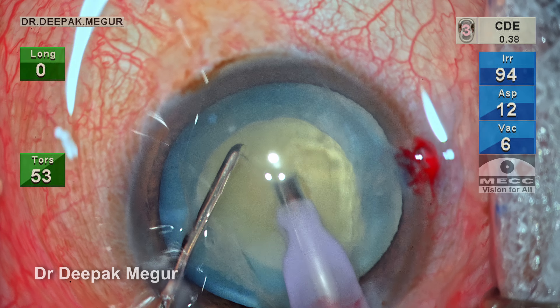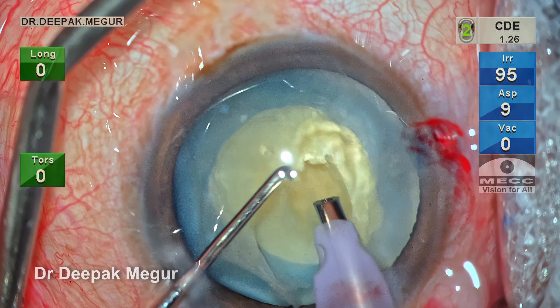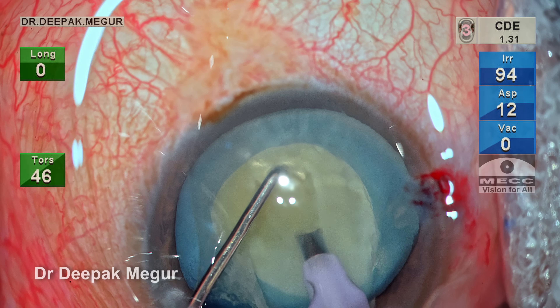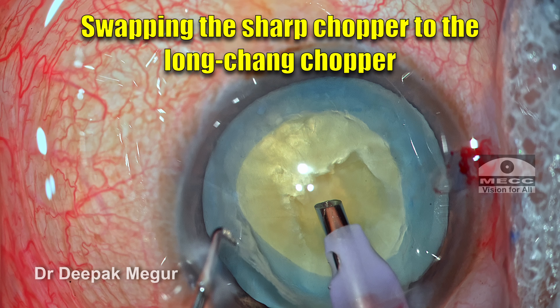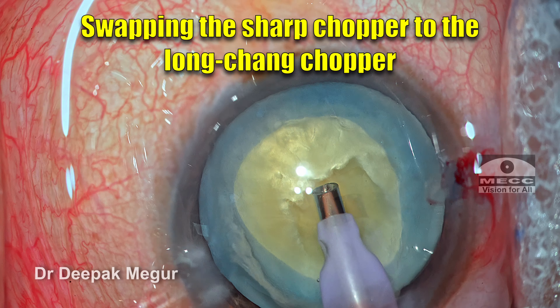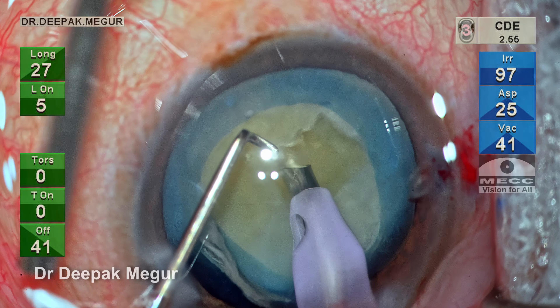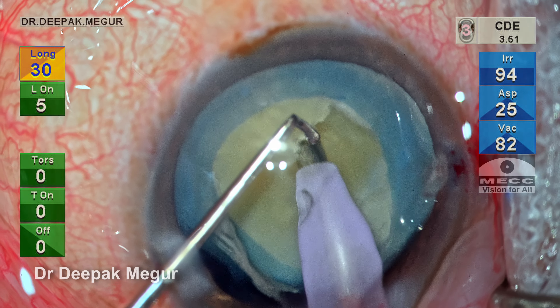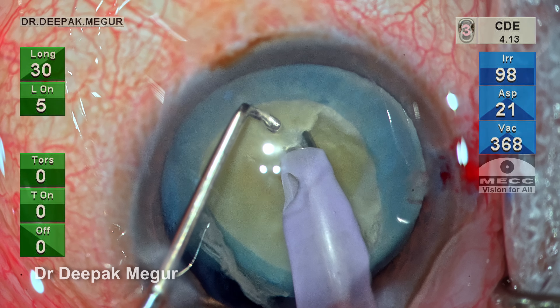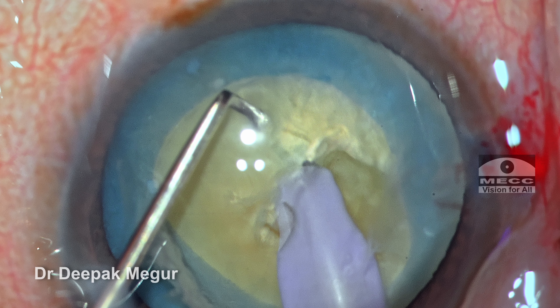To get a good hold of the nucleus, I would like to create a small central pit, which gives me access to the central core of the nucleus. I would have sculpted about 50% of a deep trench in the center. I'm going to swap my second instrument to a horizontal chopper — this is the Chang chopper. I'm going to use longitudinal energy in burst form to bury the tip of the phaco into the nucleus. A short burst of phaco is given so the entire exposed tip goes and buries itself into the substance of the nucleus.